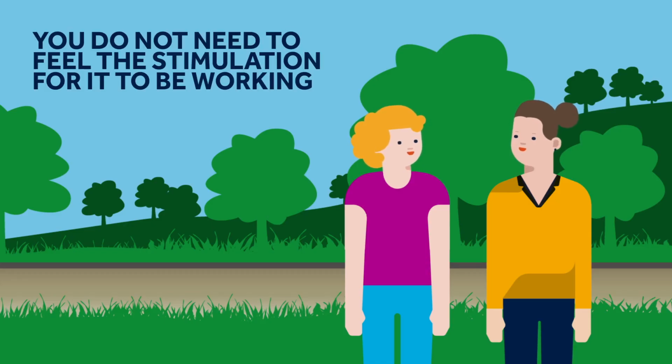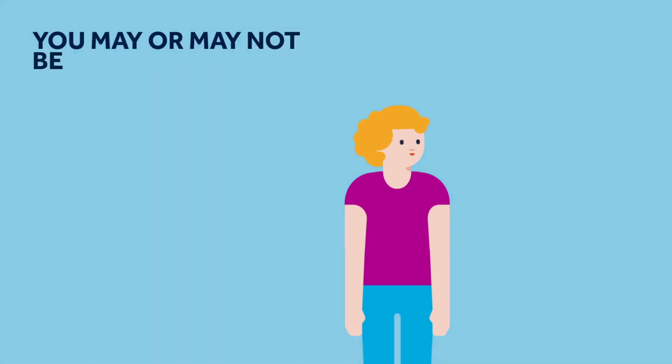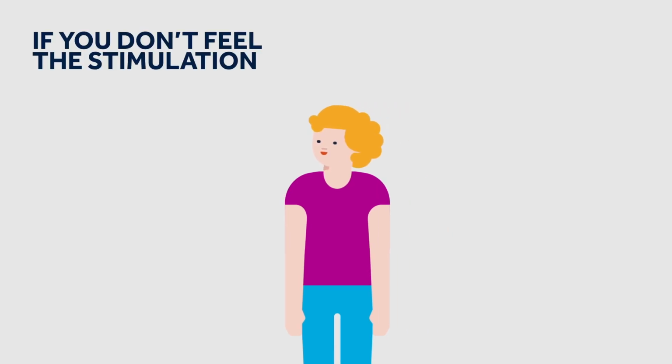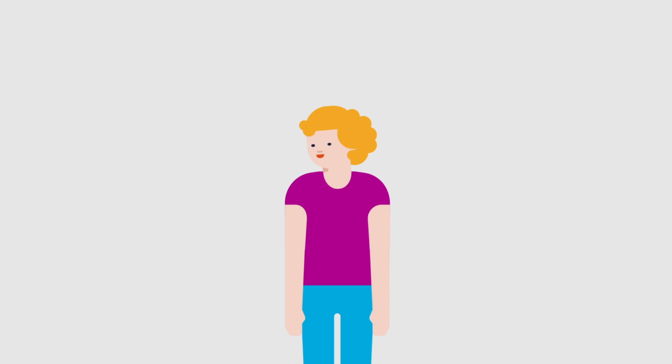Each person is different, but the most important thing is that the stimulation reaches a level where it is working for you. Your awareness of the neurostimulator and the sensation it produces will probably gradually diminish. So your stimulation level should be just over or just below the point where you can feel it. Either is fine. Many people don't feel the stimulation on a day-to-day basis, but if the therapy is working for you, this is perfectly acceptable.